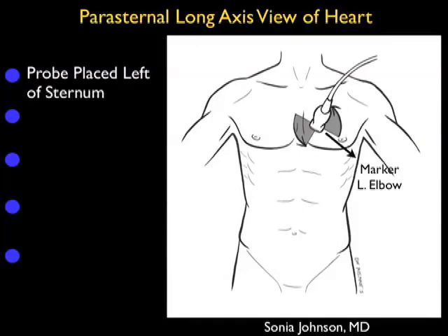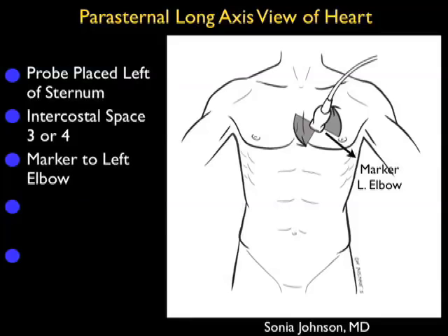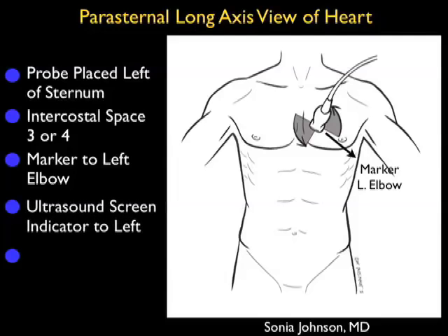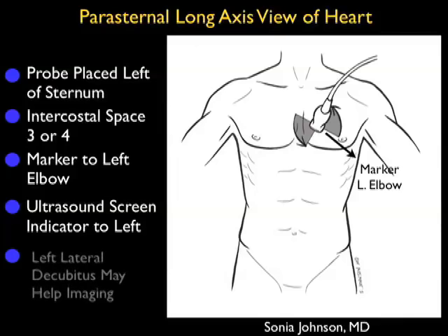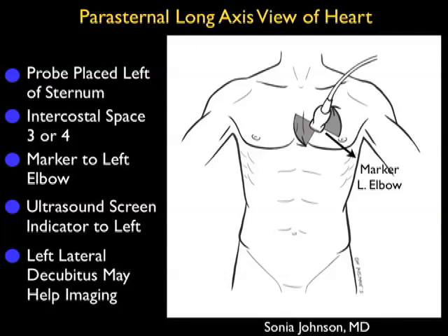For this examination, it's optimal to use a small footprint phased array type probe that can easily sit between the ribs. We're going to place the probe just left of the sternum at about intercostal space three or four, with the marker dot on the probe aimed down towards the patient's left elbow if the patient's left elbow is down by the side, with the caveat that the ultrasound screen indicator would be over towards the left of the screen. This will align the probe in the long axis of the heart.